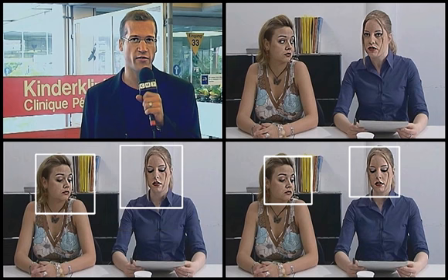If multiple faces are visible during the same shot, several conflicts have to be resolved. First, multiple faces can be magnified simultaneously if the required magnification scale can be ensured without causing overlaps within the limited screen space. Second, if multiple faces need to be magnified sequentially because the screen space is not sufficiently large for simultaneous scaling, an appropriate magnification order needs to be determined. Resolving these conflicts is not an easy task since faces can arbitrarily appear, disappear, and reappear within the same shot. Our algorithm detects these conflicts during runtime and determines the optimal placement and magnification order of faces.